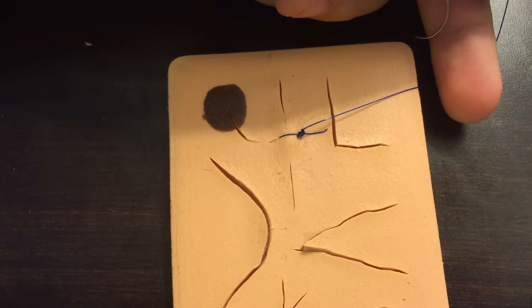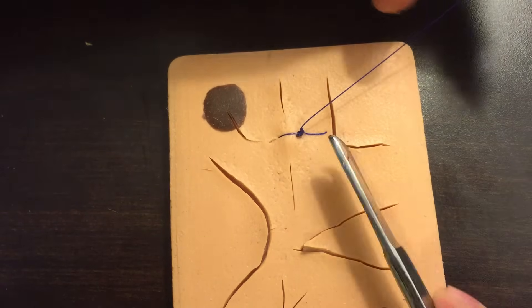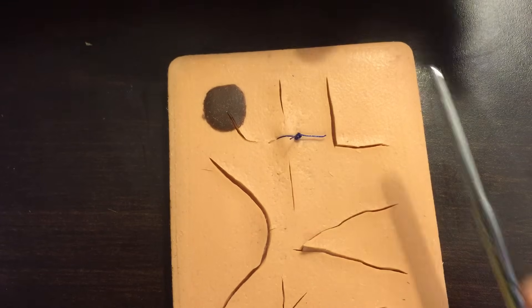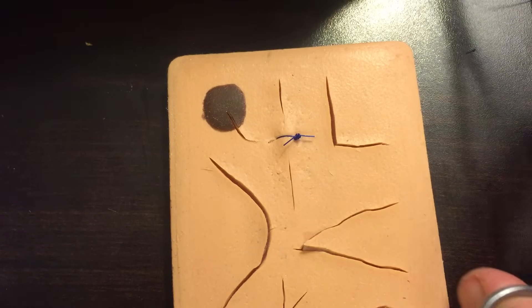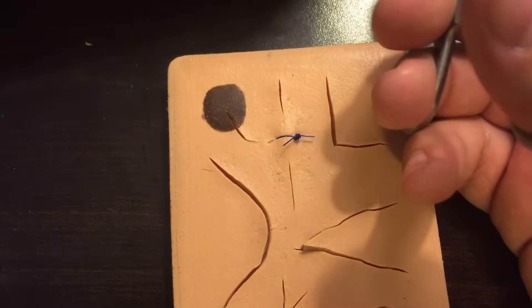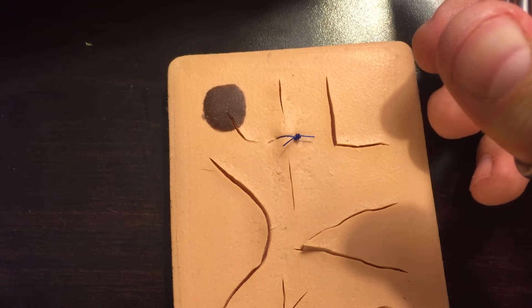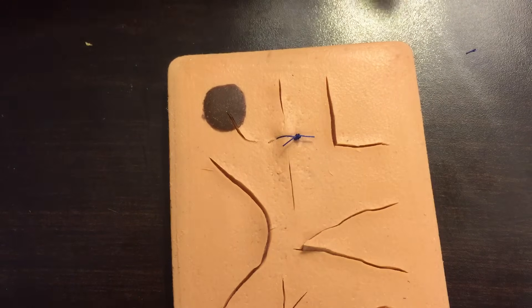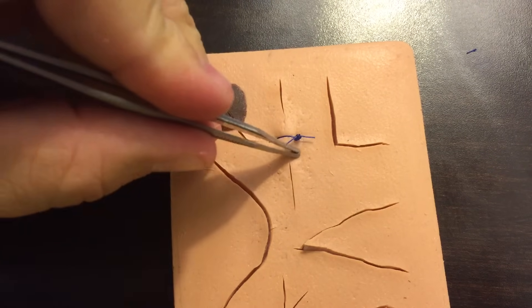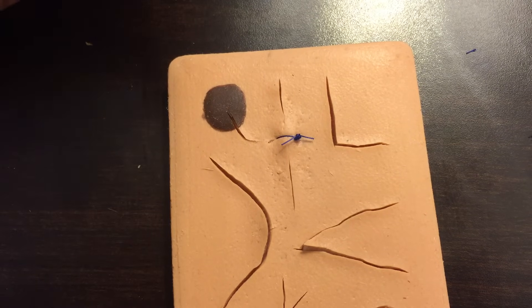Now cut the tail of the suture. There's no hard rule for how long to leave it — if you cut it too short you risk that last throw slipping out, but if it's too long it gets in the way of your next suture. You want it long enough to be secure, but not so long that it's bothersome when placing the next stitch.